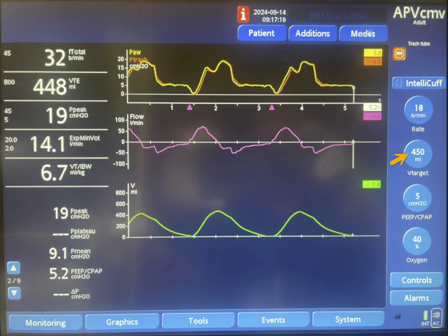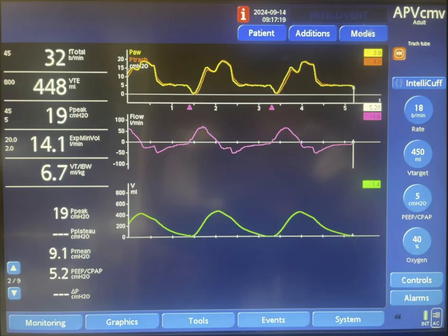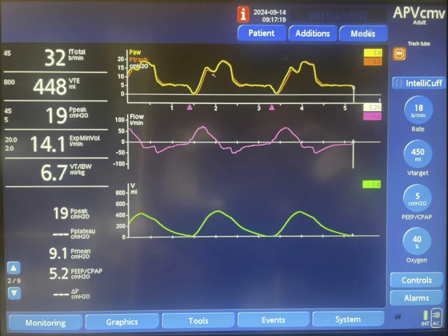The machine aims to deliver 450 ml of tidal volume every time it is triggered. It will do this with pressure targeted breaths. The pressure is determined based on a feedback mechanism from the previous breath. If the previous breath delivered 450 ml of tidal volume, the next breath will happen at the same pressure level. Otherwise, the pressure will be regulated up or down to achieve the targeted tidal volume. This regulation happens gradually from breath to breath by two to three centimeters of water.